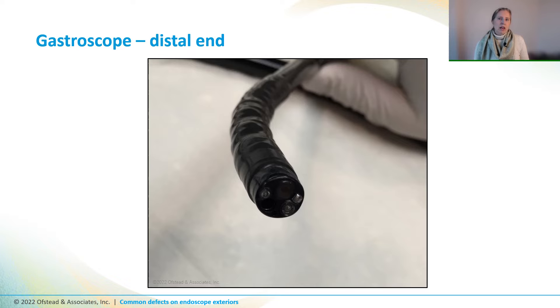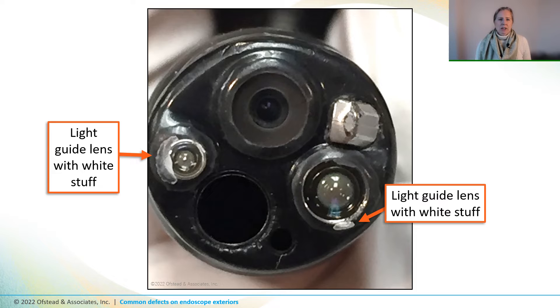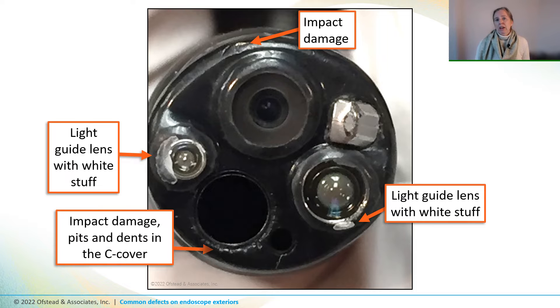Here's a gastroscope that looked pretty good at first glance. But when we looked at the distal end with magnification, we could see that the light guide lenses have some strange white stuff around the edges. That might be adhesive that's flaking off. There are also dents or gouges around the edge of the instrument channel, and the edge by the auxiliary water channel outlet looks like the distal end cap might be cracked.